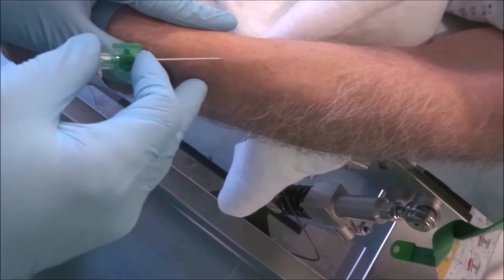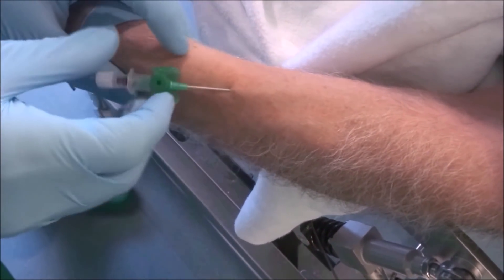Hello, today we try to put an IV according exactly to the hygienic standards of our hospital.